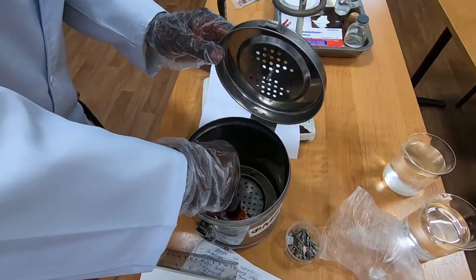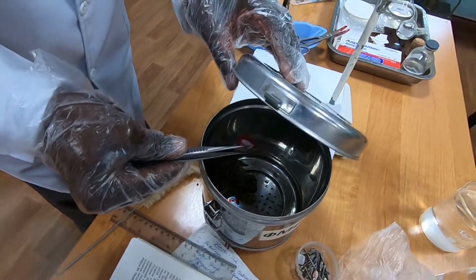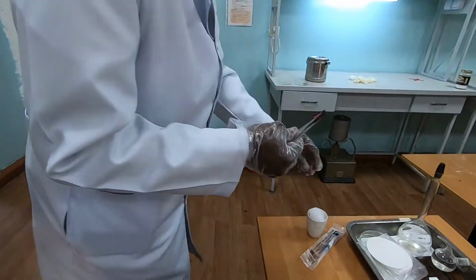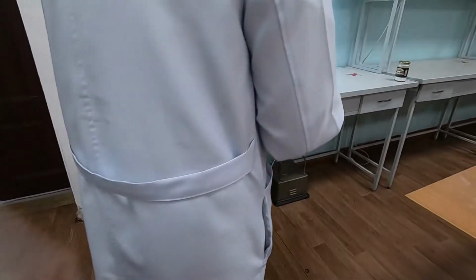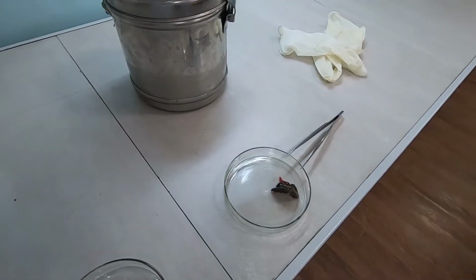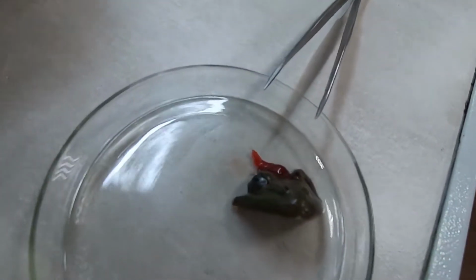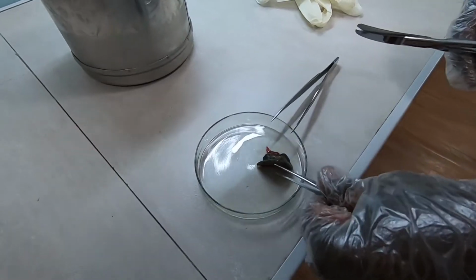Okay, dear students, let's do the reaction of adrenaline on the eyeball. So we'll bring it here. Let's take one of these. What we have to do is to remove the eyeball.